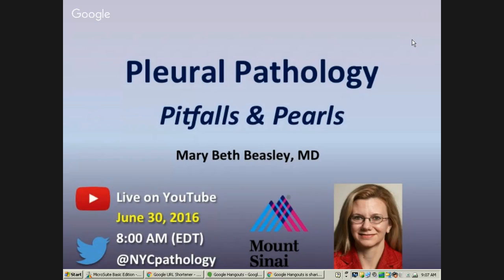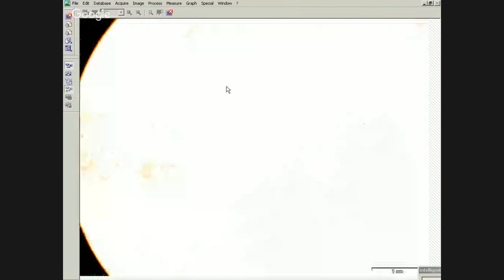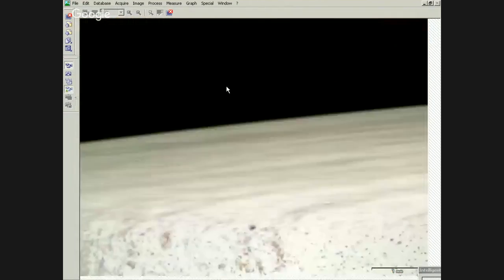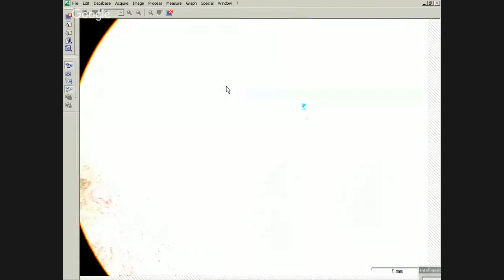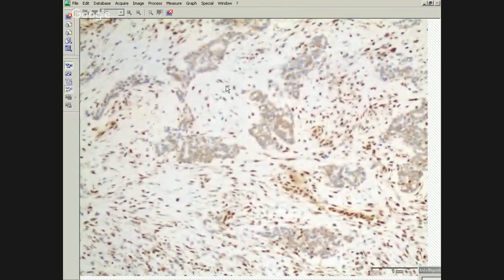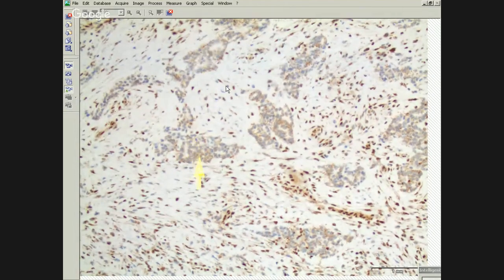So that one is immuno? Yeah, I actually brought one to show you guys. We've only had this marker a few months, but this was the first case that I showed you. So it should be a nuclear stain. It stains things besides mesothelial cells, but if you look at the mesothelioma itself, it's negative, right? So you can see you've lost the nuclear staining in the tumor. This is BAP1. Yeah, so you've got BAP1 loss in this particular tumor.